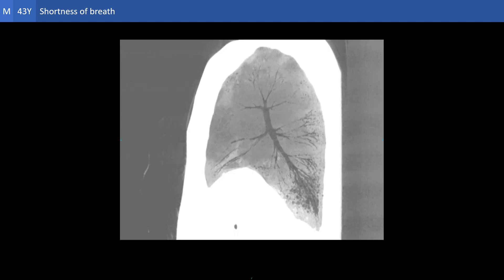The minimum intensity projection is a nice technique that can be used to appreciate the bronchiectasis and the honeycombing. Here we can clearly see the sectorial distribution of the disease and the relative sparing of the lung in between the involved sectors. We can also see the bronchiectasis going all the way down to merge with the honeycombing at the periphery of the lungs.